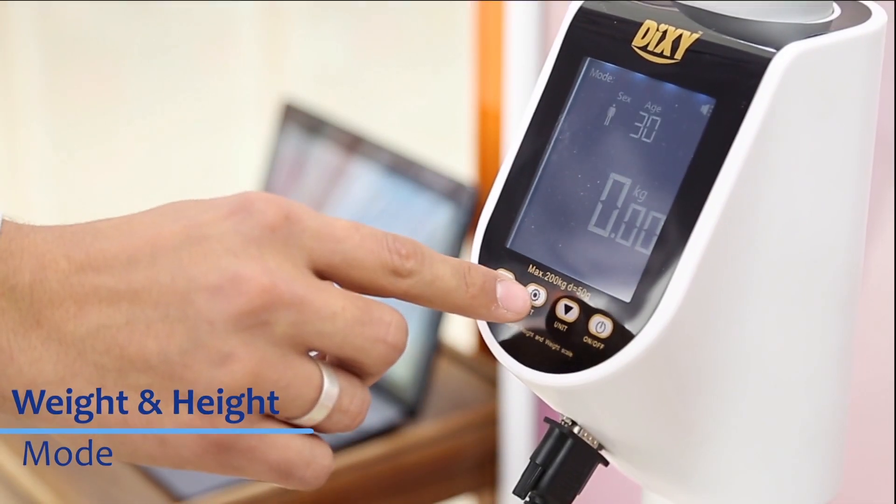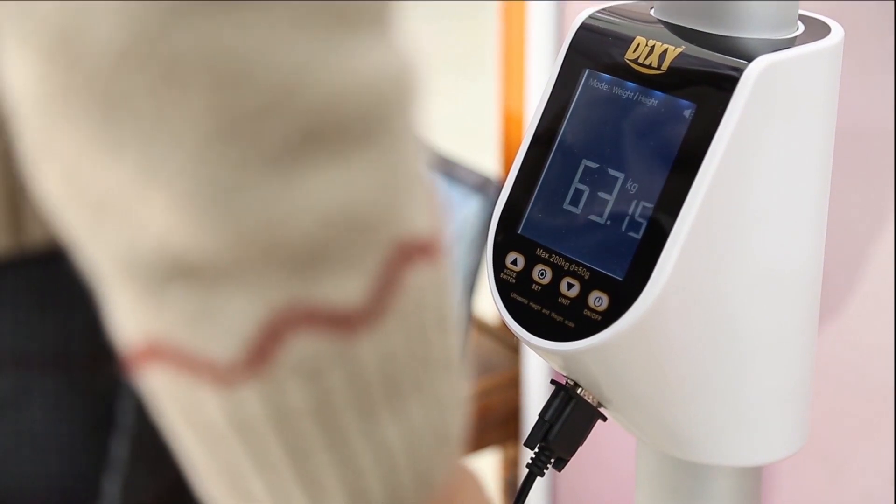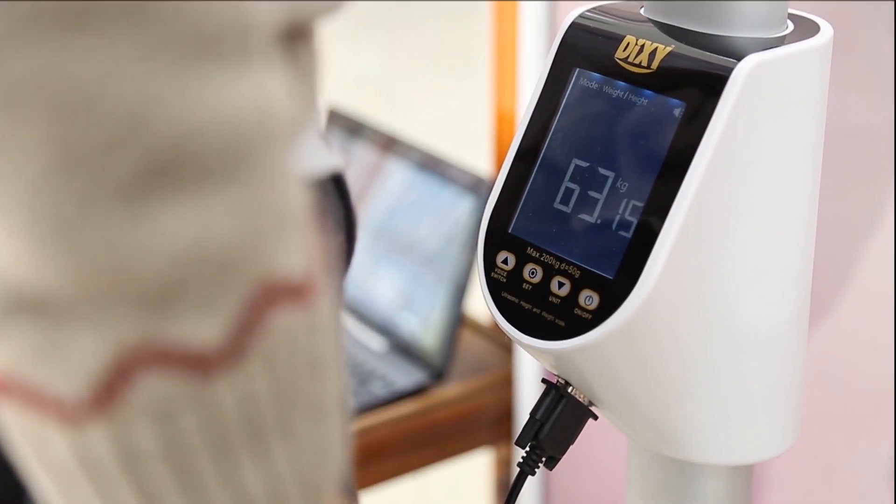Now let's try Weight and Height mode. Stand on the scale. The scale measures height by ultrasonic waves. After measuring, results will be displayed on the screen and the scale will speak out the results.